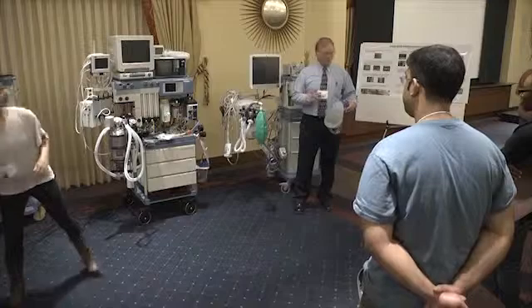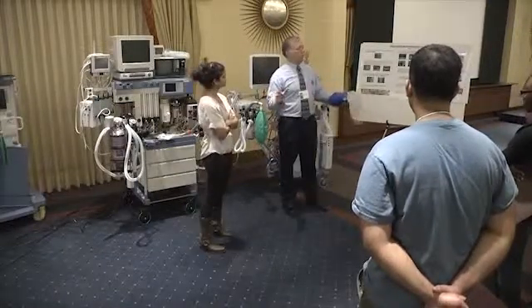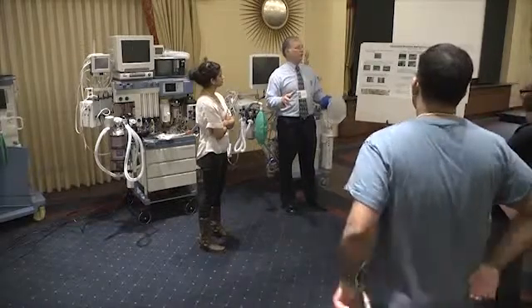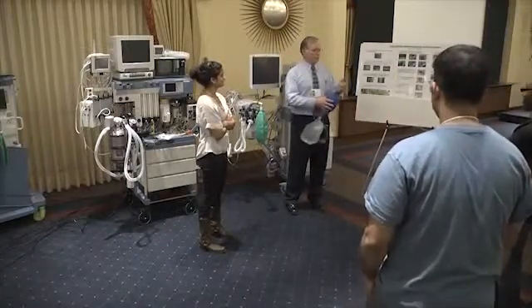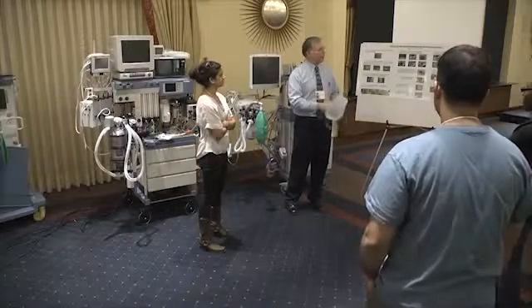And in our facility, we noticed a problem with our ambu bag, and we fanned out through the hospital to check every single ambu bag in the hospital. And we found that we had a 10% failure rate, which was exceptionally high. And what the problem was, is when you squeeze it like this, it worked. But when you put your hand over here and squeeze it, it poured out of this seal in the back where the plastic leaked to the rubber.